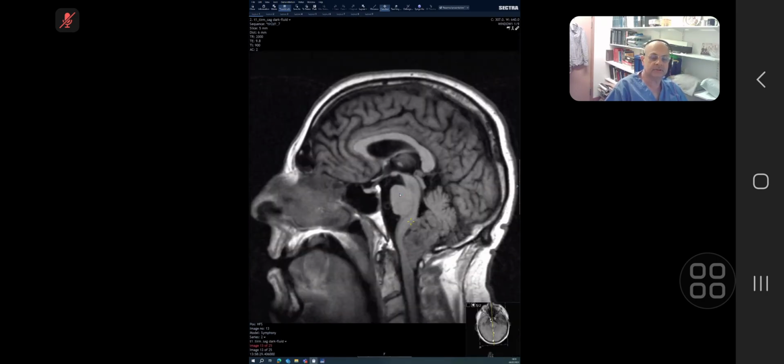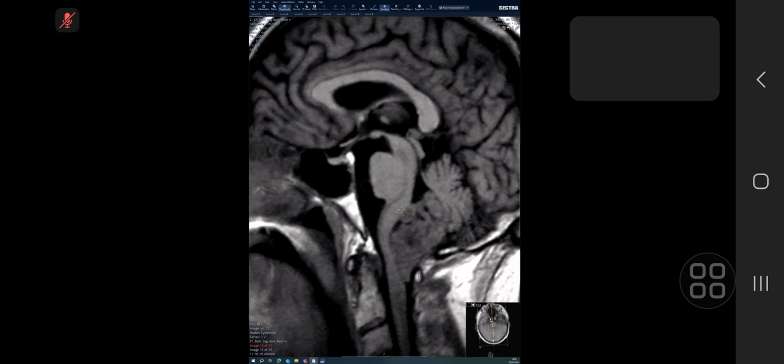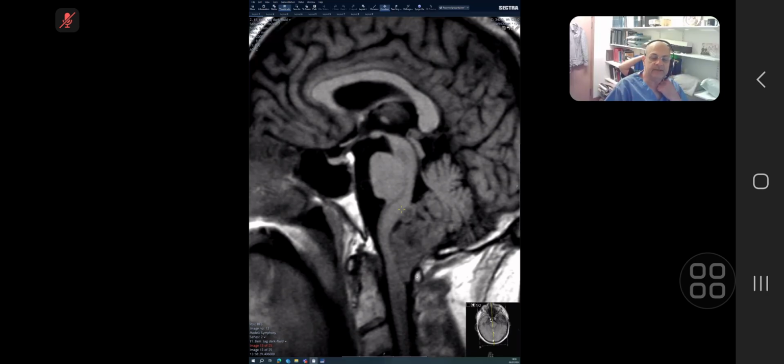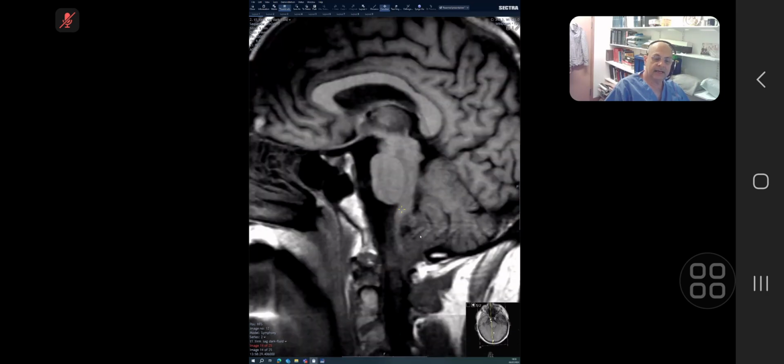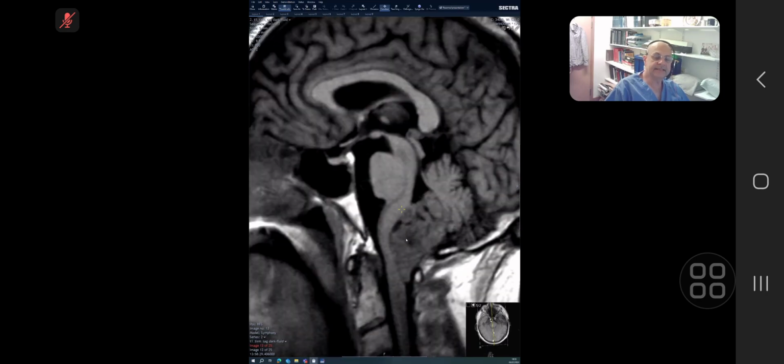One of the sequences can be orthogonal, so it's better to see orthogonal. On the T1 weighted sequence, I can see the cervicomedullary junction being displaced. I can see a soft tissue mass which is lying posterior to the cervicomedullary junction. There is no relationship of it with the C1 posterior arch or with the posterior aspect of the occipital bone. I can't separate cerebellum versus this tumor, but I can see the cerebellar folia on the sagittal images slightly separate from it. Its density is separate.